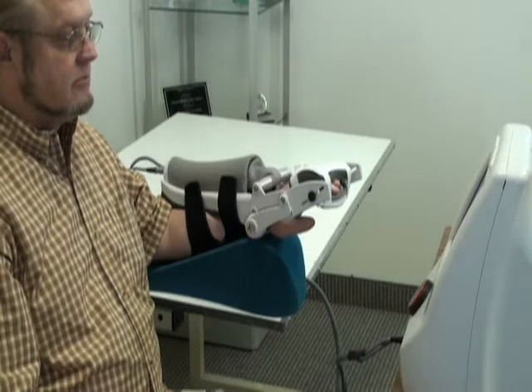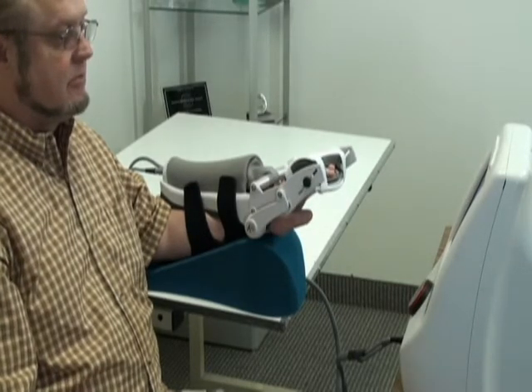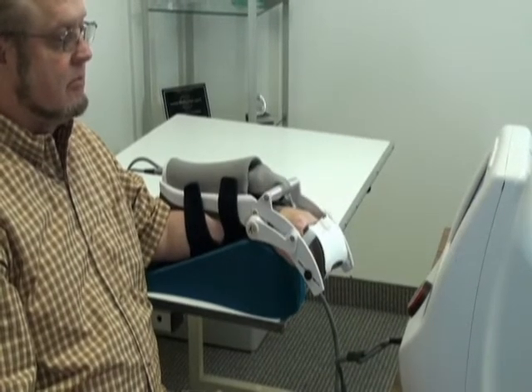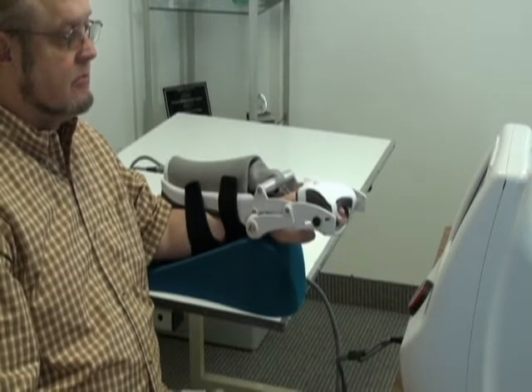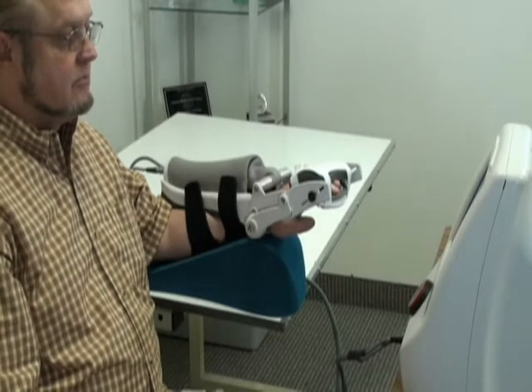Teach the patient breathing or relaxation techniques and encourage them to watch the thermometer and realize that they have control over the amount of tone in their wrist and finger flexors. This program is a good warm-up before attempting any motor control exercises and is also a good cool-down after a session of motor control exercises.